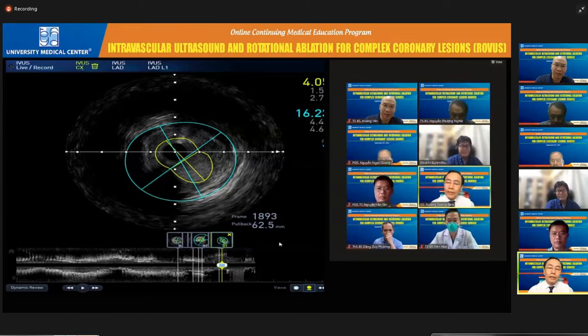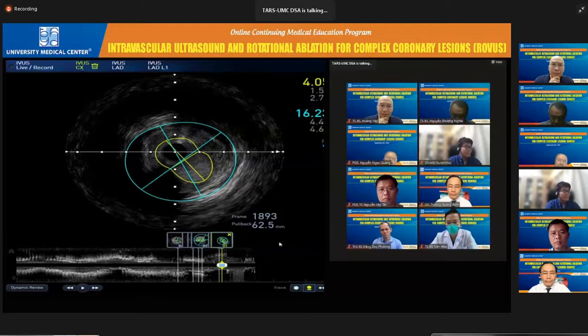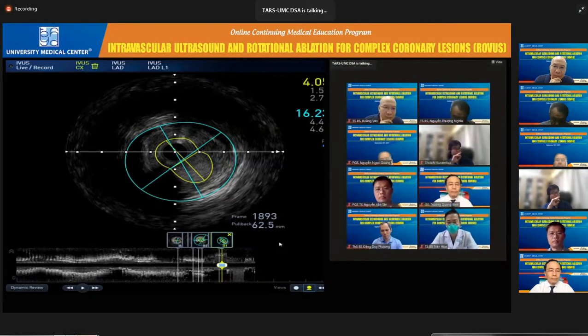So 4.0 is a significant stenosis of the left main. So we can do PCI for the left main now. Dr. Wu, may you continue the procedure? Yes. Please show me, because we measured the distal left main by two pullbacks. The first one from the LAD, the second one from the circumflex, to make sure that the measurement is correct. So this is the 4.0 from the circumflex pullback.